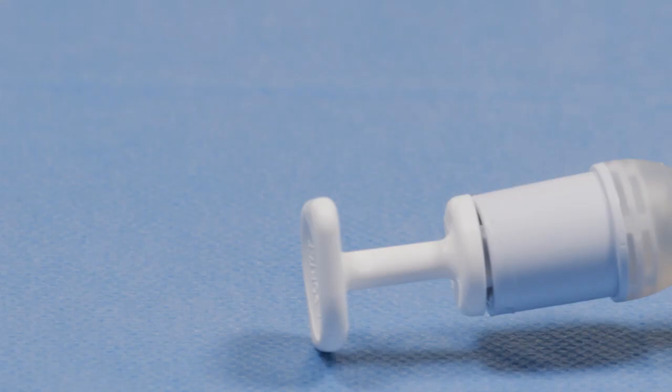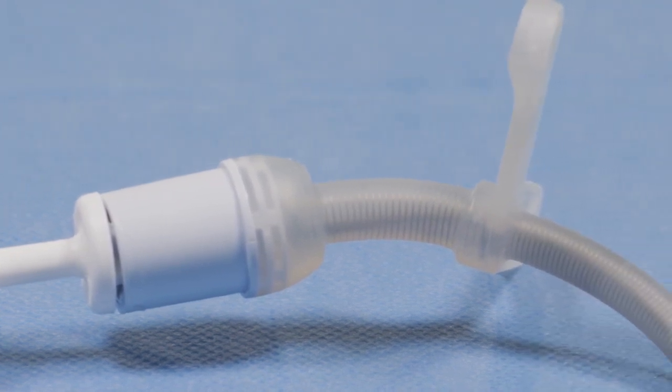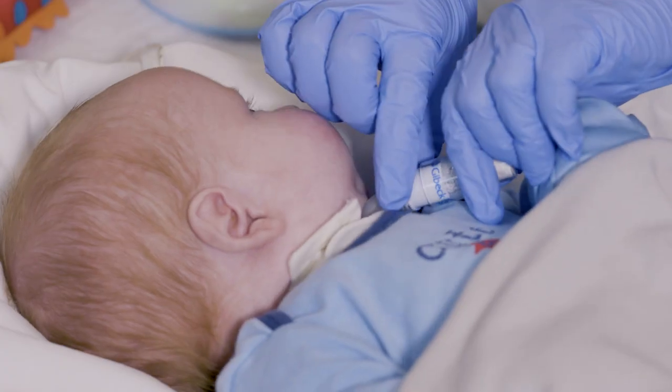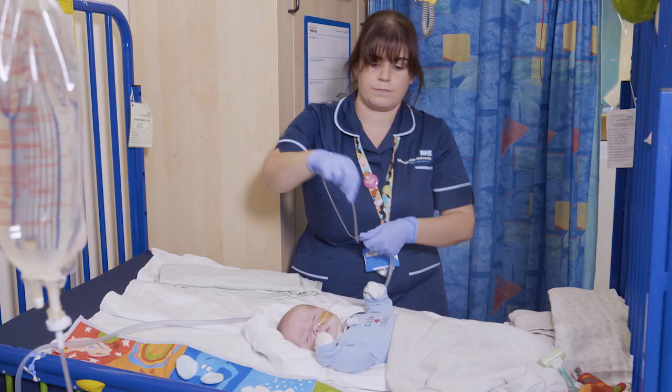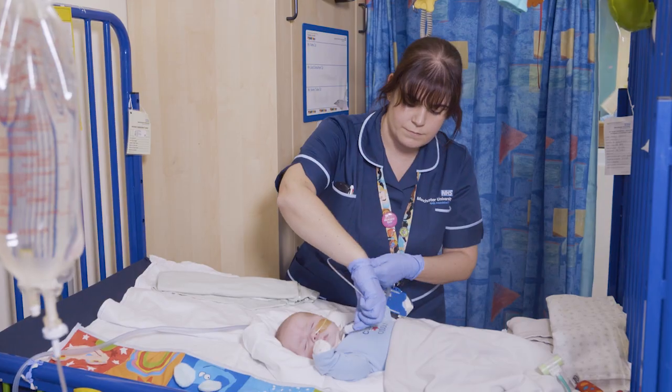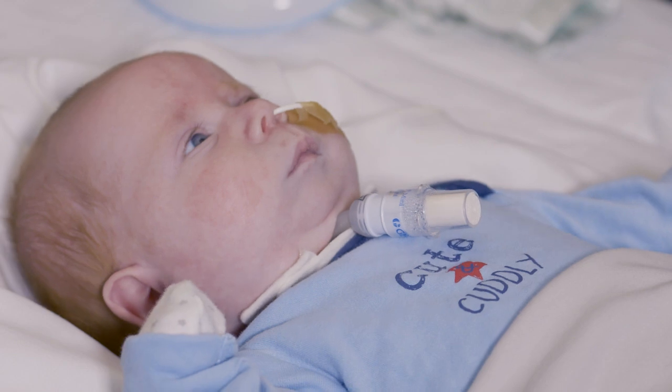Bivona tubes actually come in a FlexTen tube, which means it has an extension that brings the tube further out for babies that are quite chunky or have small chins. It just makes it easily accessible to suction. It also helps children with their natural head movement and stops the stoma sites getting sore.